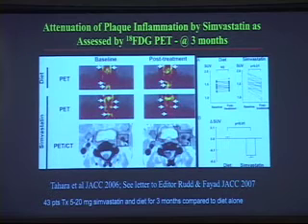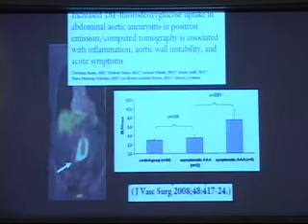So you can see here, after the use of simvastatin 5 to 20 milligram, baseline imaging and then post-treatment, the artery in the carotid got much quieter. So this is why there's a lot of excitement in potentially using this to follow different types of drugs in terms of cardiovascular treatment.